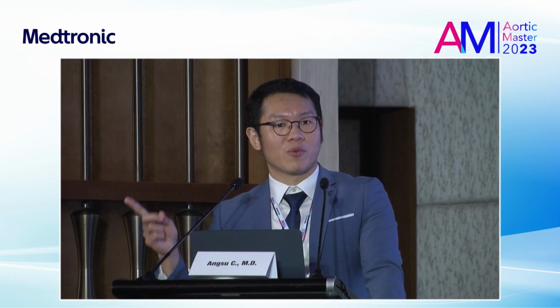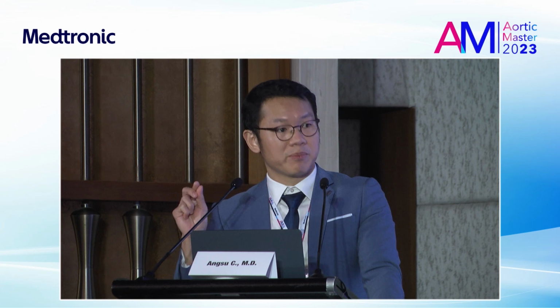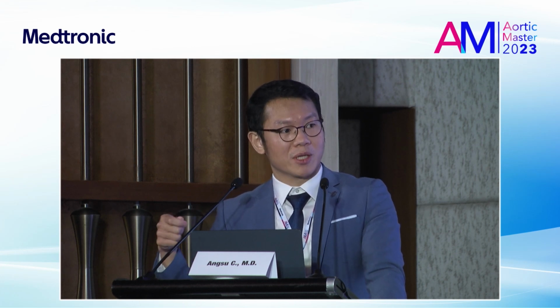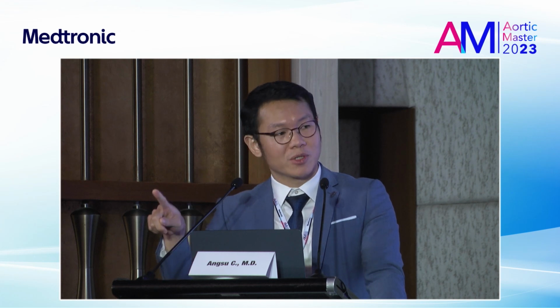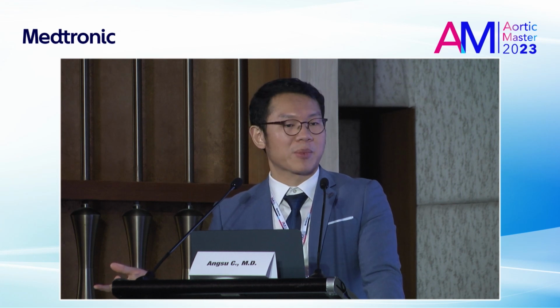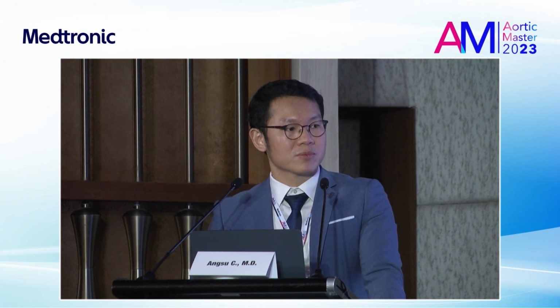So normally we use the right axillary artery, one thing, and we have the perfusion catheter. So you cut the carotid and close the proximal part, and you let the perfusion catheter go into the carotid and subclavian, anything that you want. Okay.